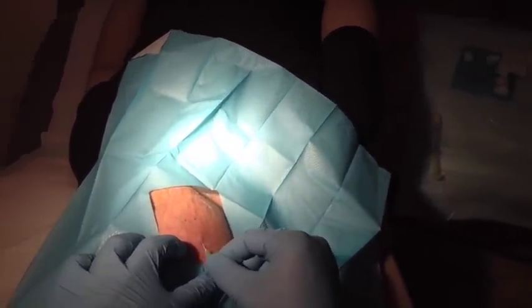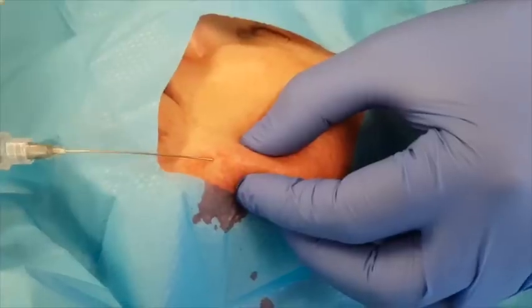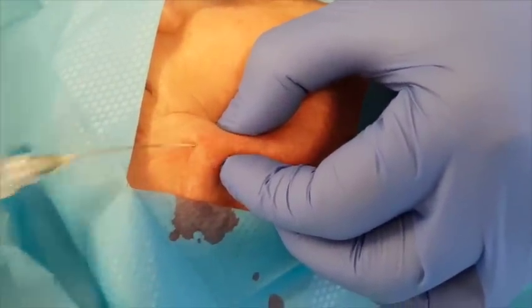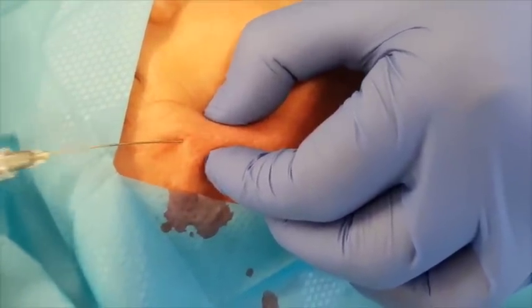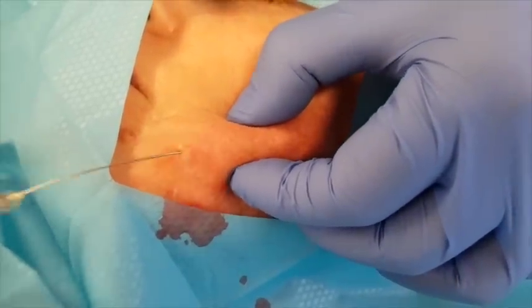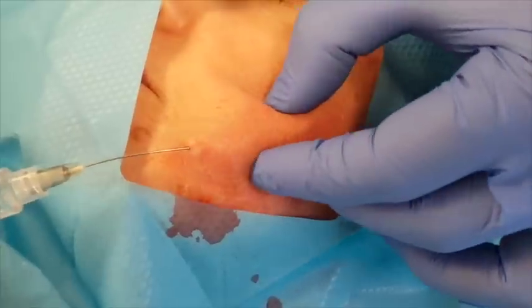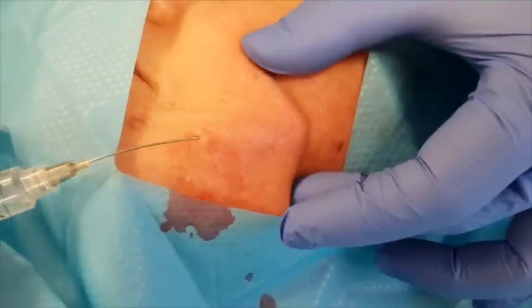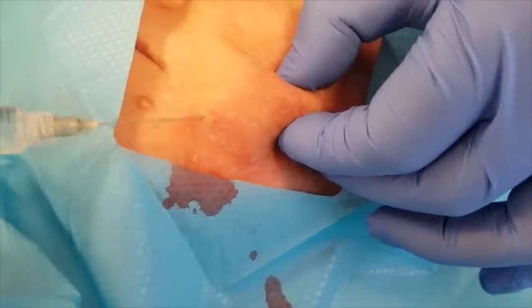That's why I annotate my minimum standards rather than my novel techniques. This is cannula subcision and I find this a much safer technique. It's not filling — I'm not doing dermal filling here. You can see I'm actually breaking the bonds down. I'm pinching and you can see the bonds breaking up as I work through the scar tissue. My standard go-to cannula nowadays is a 22-gauge TSK cannula — they are very stiff with good Japanese metal.